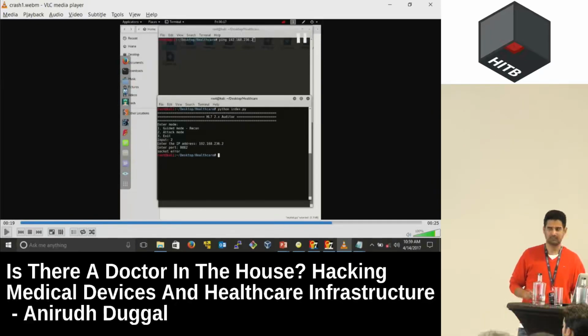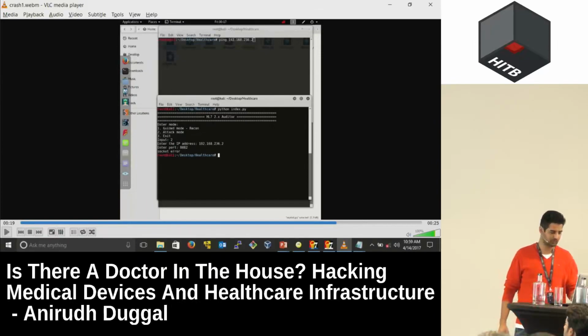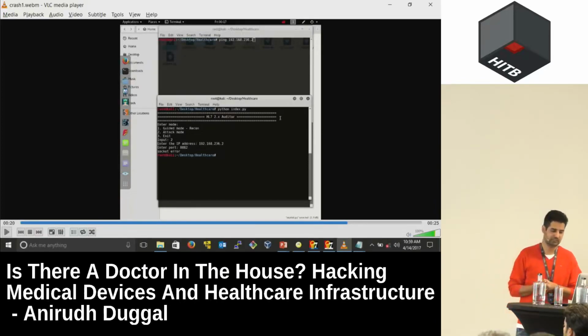The thing is that I sent this AAA, which was very, very big. It was actually bigger than what I showed right now. And I got a socket error. On the other side, that device actually crashed because it was not able to hold that memory. And you'll see these examples a lot. I cannot stress this more.